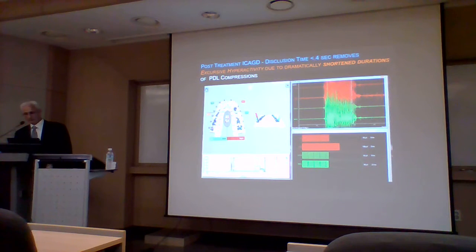So in the post-op, you see she bites down, holds her teeth together. Now she moves to the right, and you see the red quadrant takes control right away. That's the anterior guidance. And the blue quadrant disappears very fast. 6번 컨택을 없애주고 난 다음에 오른쪽으로 레터럴 무브먼트 시키니까 빨간색 그래프가 확 올라가는 게 보이죠. 파란색 컨택은 확 줄어들고 있잖아요.